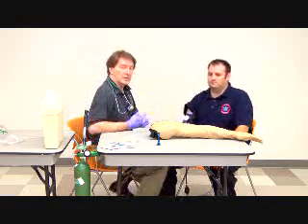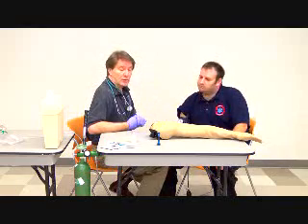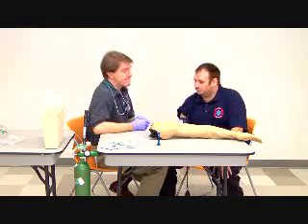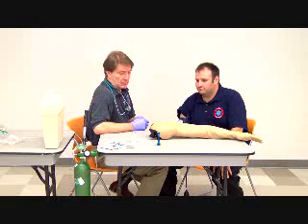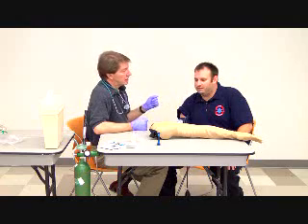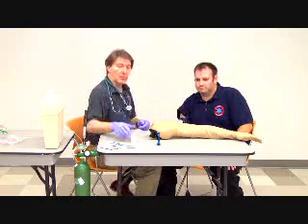Now, I believe and suspect that this patient may be having an anaphylactic reaction, so I'm going to contact medical control for orders. The medical director orders you to administer 0.01 milligrams per kilogram body weight of 1 to 1,000 epinephrine. Okay, how much do you weigh, sir? 235. Okay, so this patient is going to get 0.3 cc's of epinephrine.